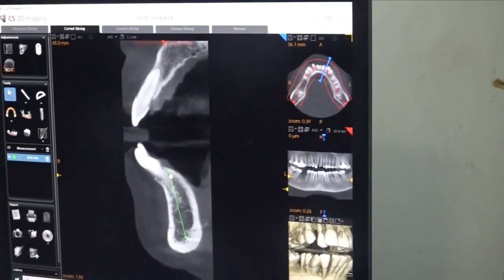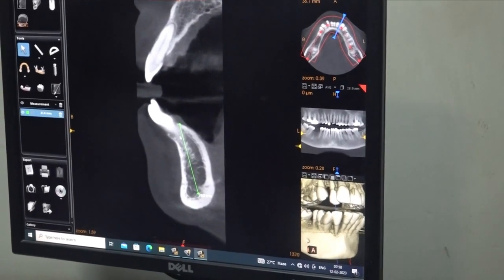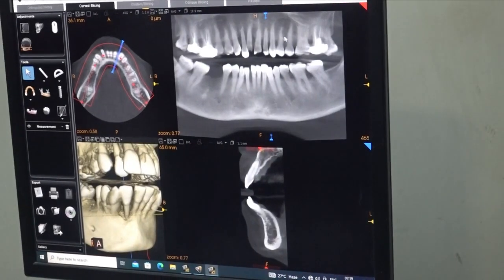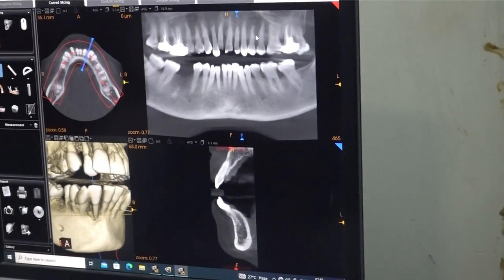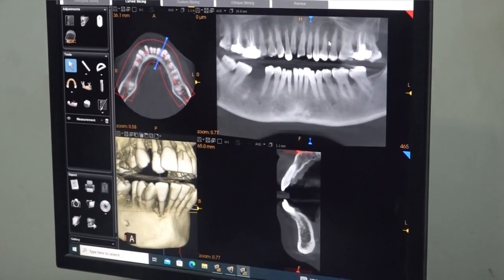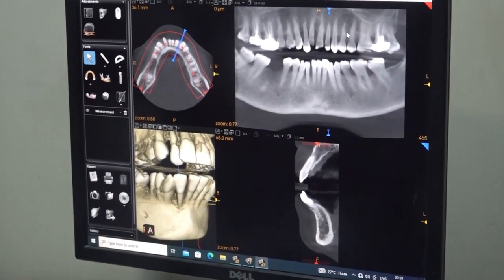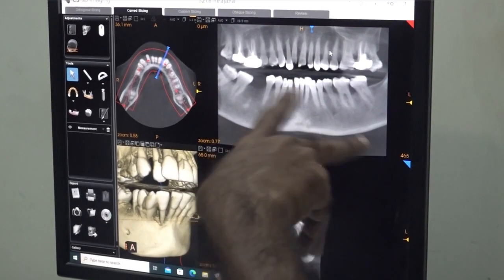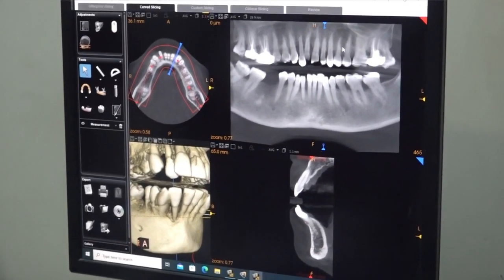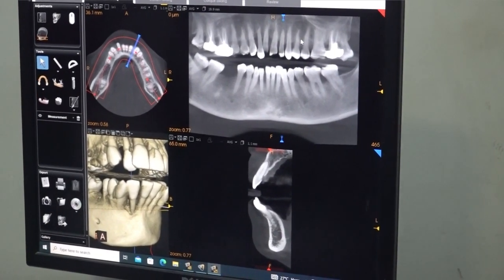Since the canine bone is very porous, we will select a larger diameter implant to get stability from the crestal bone — 4.1 or 4.2mm for the canine implants. Next to the midline, where bone quality is better, we will select 3.75mm. By choosing different diameters, we also ensure there is enough inter-implant distance. If all 4 implants were 4.2mm, the inter-implant distance would be compromised.